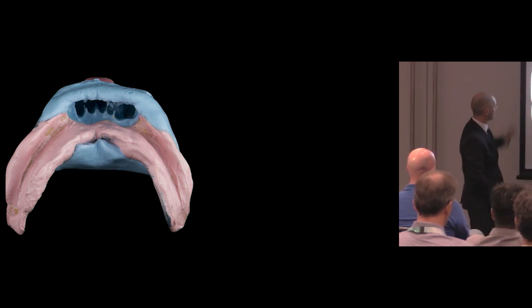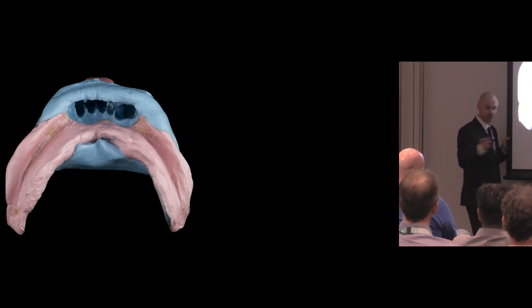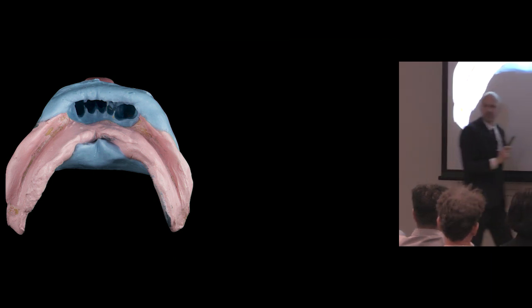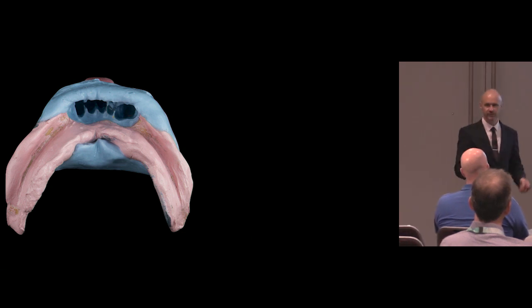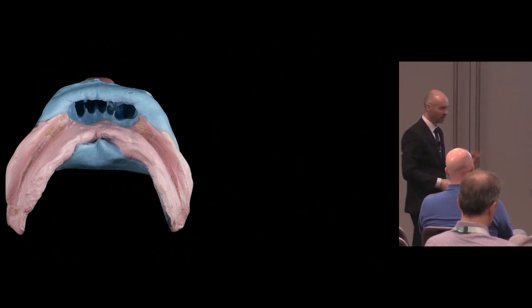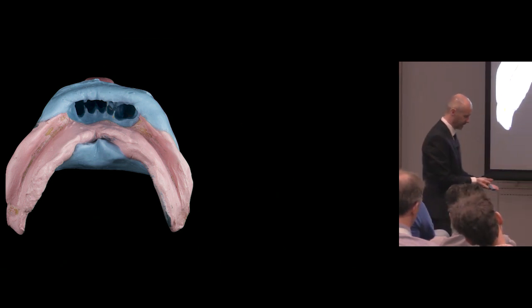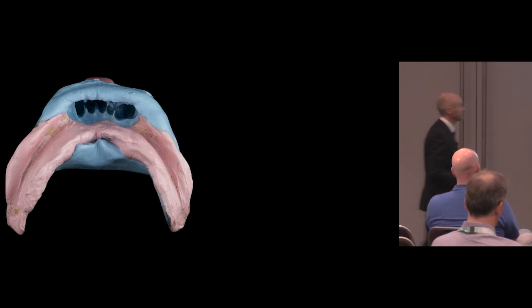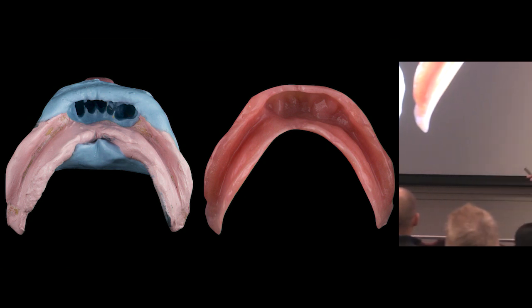So this is the approach here. And look, I'm not stressing about this touching the ridge, no big deal at all. Because if it was sore when I fit it, I'll be able to know, and so it's not like being back at dental hospital where you go, take it again. Because it really is irrelevant, actually, I think. And Rowan replicates it really beautifully in the final product, just there.